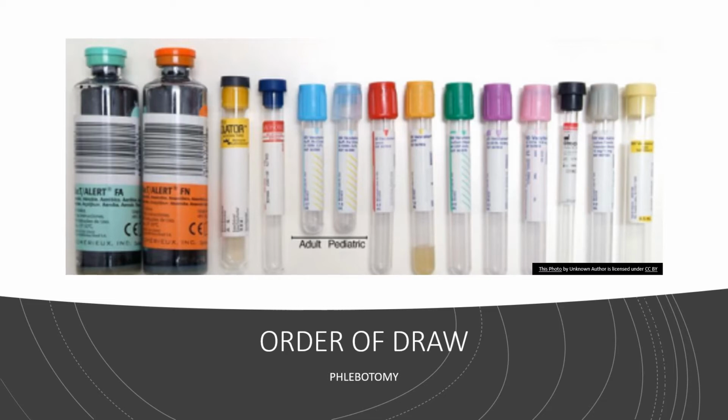And the sun, of course, is yellow. And so we refer to that yellow sun in the mode of this first normal size tube you see here that is yellow, because that is a tube used in blood culture collection. So the blood cultures are usually, just to make it simplified, in the picture referred to as either a yellow top tube or blood cultures.